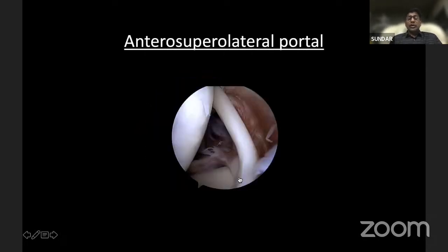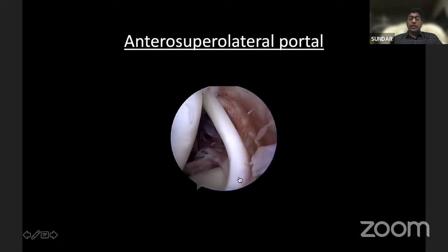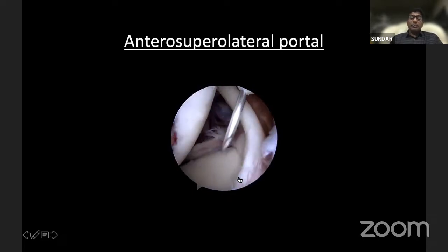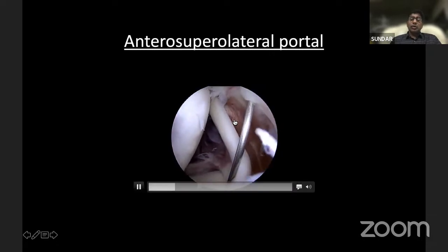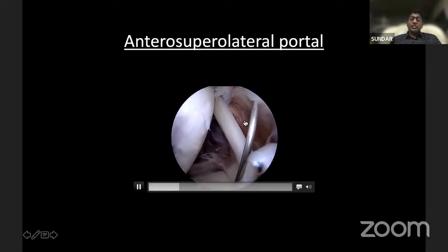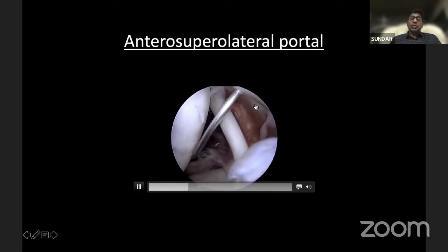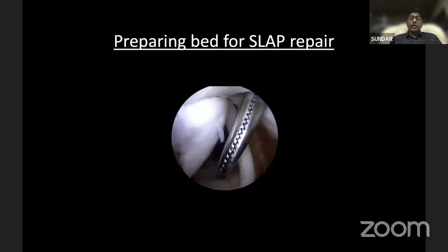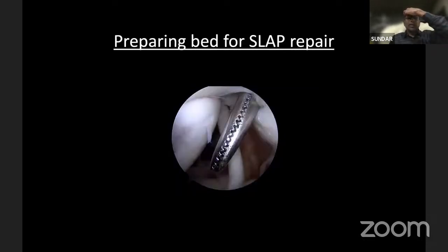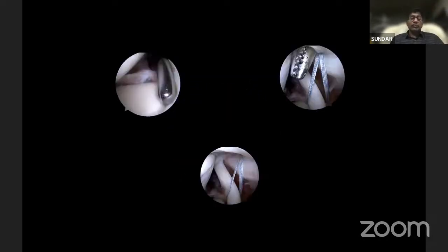So you can deal with the labral SLAP tear first, and then go to the anteroinferior labral tear next. When you do a SLAP repair, you can come through the same standard portal, or through the rotator interval itself. Sometimes the trajectory may not be good enough, so you can make a small portal in the anterior supraspinatus just to insert your screw. You can use a knotless anchor or a knotted anchor. It depends upon your comfort level.